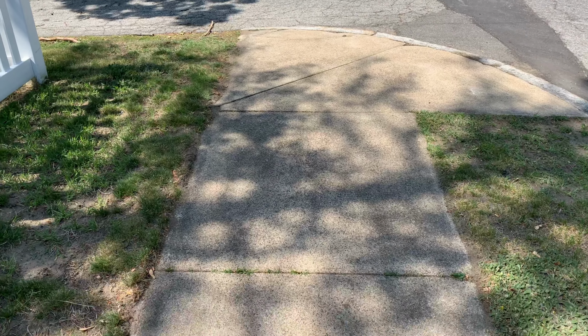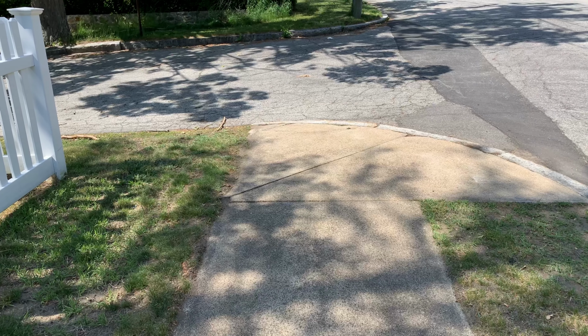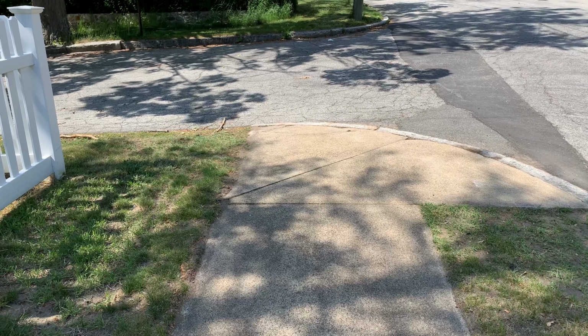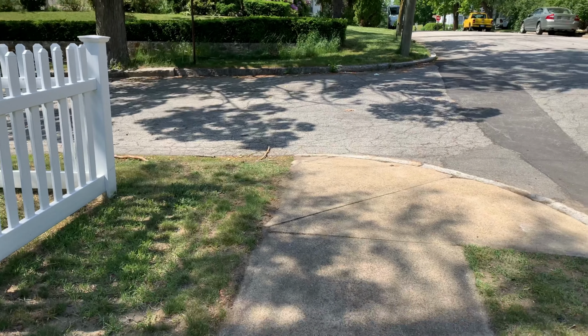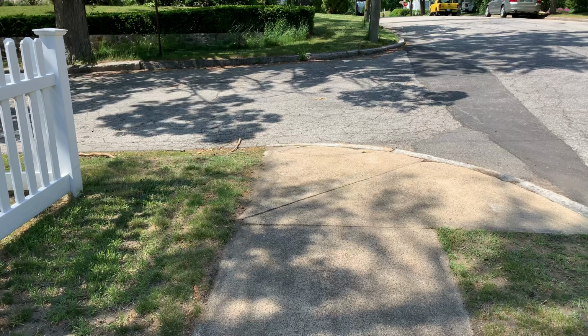So right now I'm on a residential sidewalk. I got the corner in front of me and it's a curb, so there's actually maybe 4 or 5 inches between the top of the curb and the street. So there's several different ways to locate corners. Another way is to use cars as a sound source, but right now this is a very quiet residential area, so there's no cars coming. So my main way is going to be using the cane to feel the drop off of the curb.